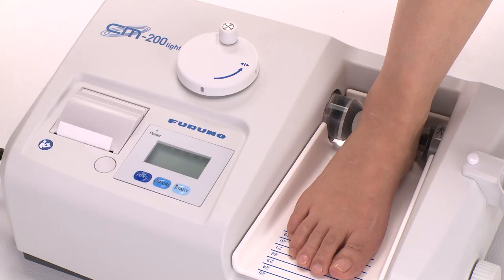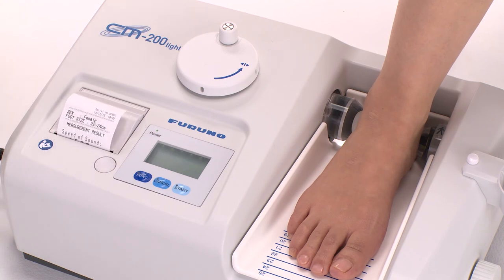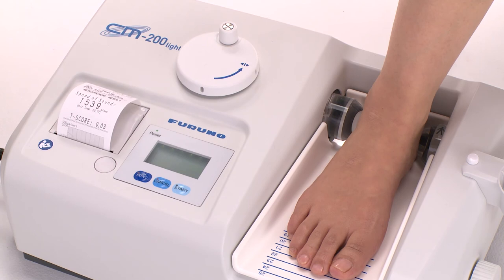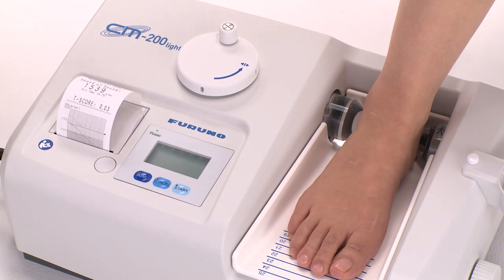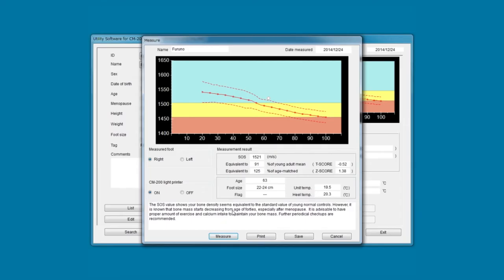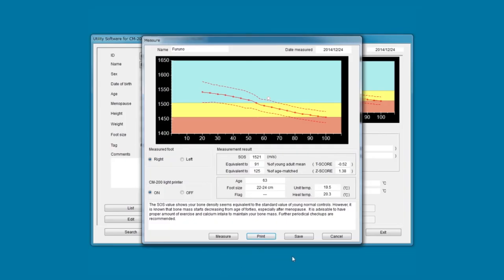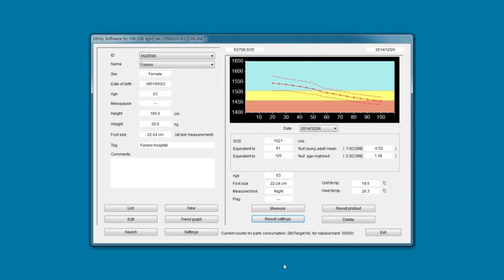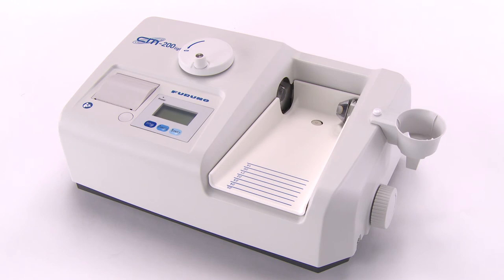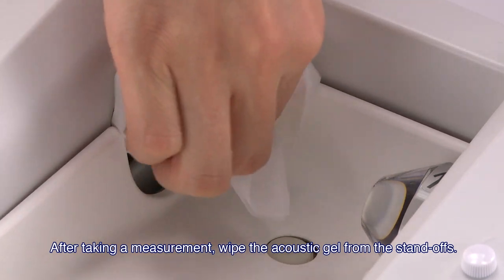When the measurement is completed, this screen is displayed. If printing was set to on, the result will be printed out. If printing was set to off, the print and save buttons are now active. Clicking the Print button will print the measurement result on the printer connected to the PC. Click the Save button to save the results in the software database. This completes the measurement procedure. After taking a measurement, wipe the acoustic gel from the standoffs.